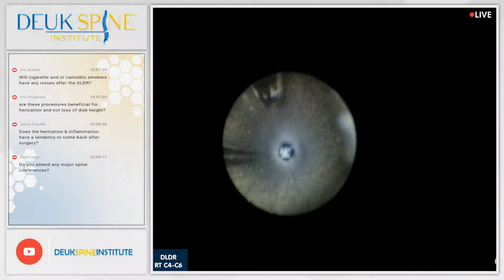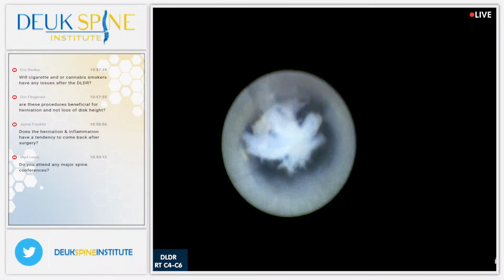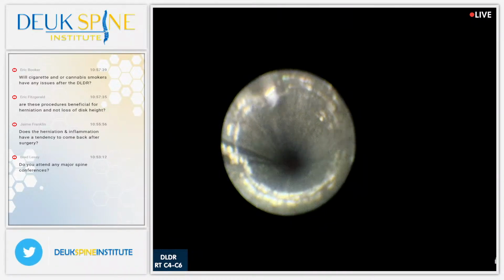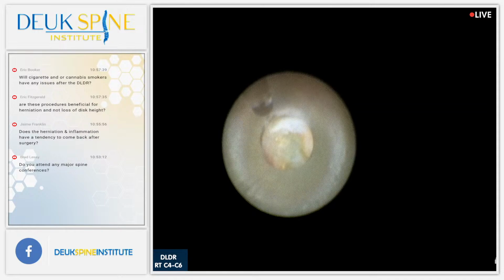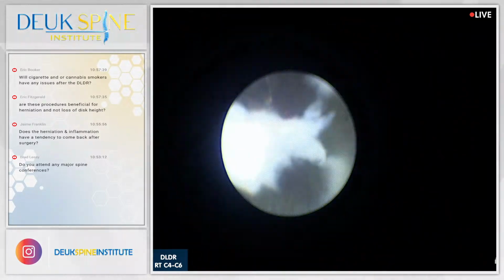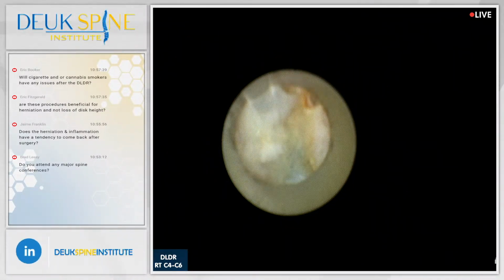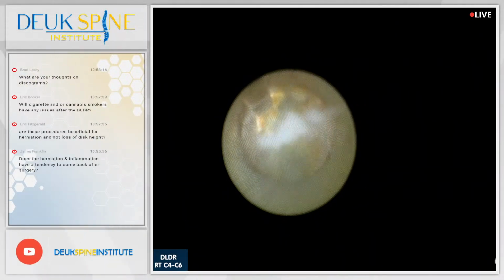We've taken out about 30 plus pieces of herniation. There's another one. This is a more recent piece. See how fibrillary it is? All those like tentacles, and that means it hasn't been scarred up too much. That means it hasn't been around too long. So it's more recent. And again, the highlight here is that herniated discs are a dynamic process. It's not a one-time thing. It doesn't just happen at one episode. It happens over years, and you get more and more herniation.